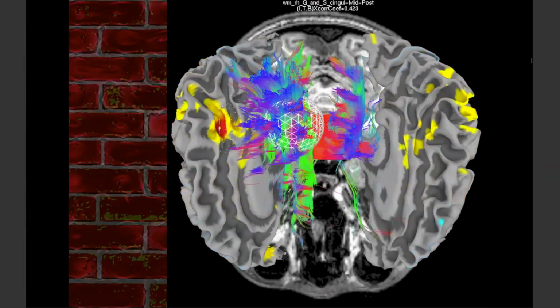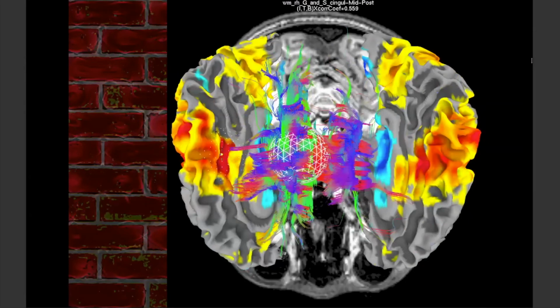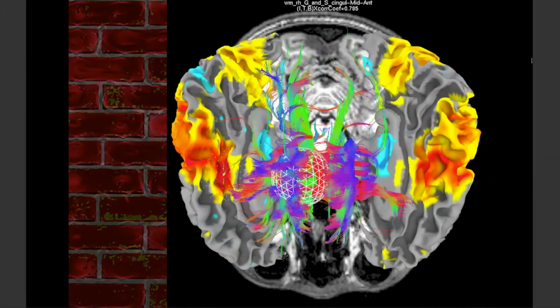That's how I produced these slides, trying to click relatively regularly as I moved along the brain. You can see, for example, there's one where there's less color, so it's a little clearer. Like here's the seed, right? And that's correlated a lot with the stuff on its own side, and then on the other side there's a lot of correlation. And you can see the tracks that pass through the corpus callosum, I suppose, like this. But there are little tracks that go to other places.